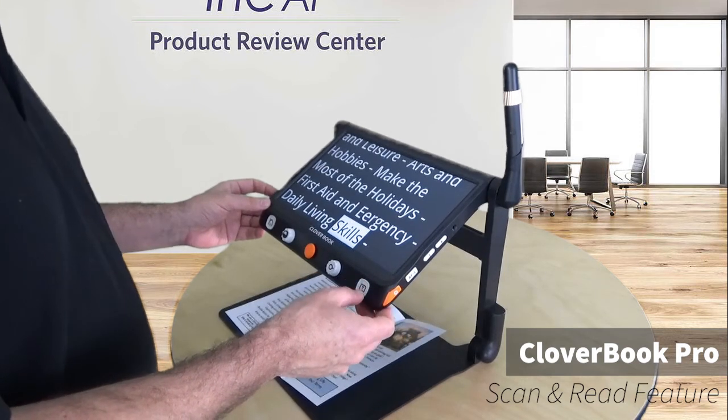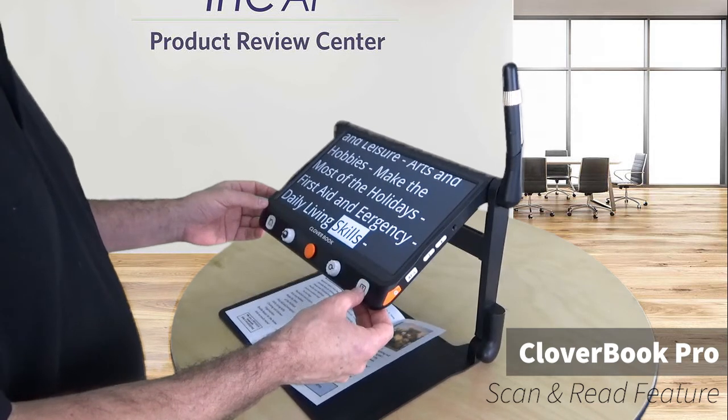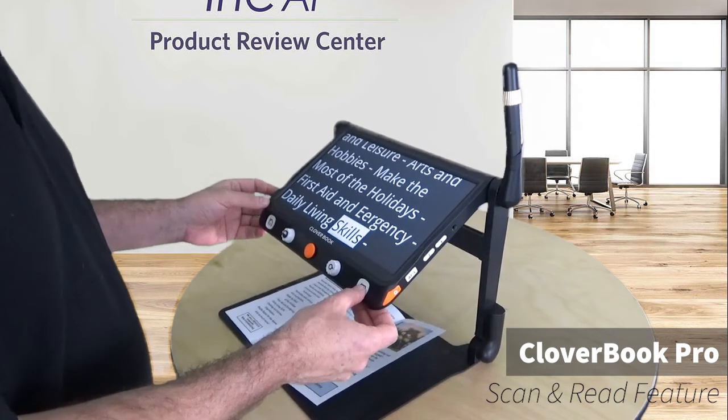There's on-screen controls, or there's also button controls. So I use this T button I've been using to scan to start and stop the text.